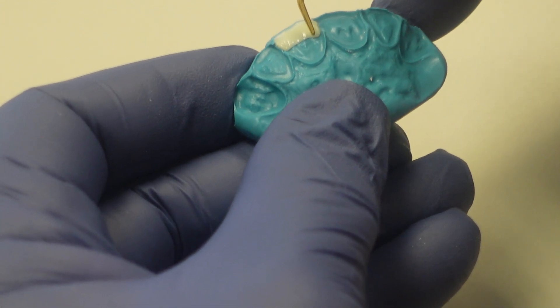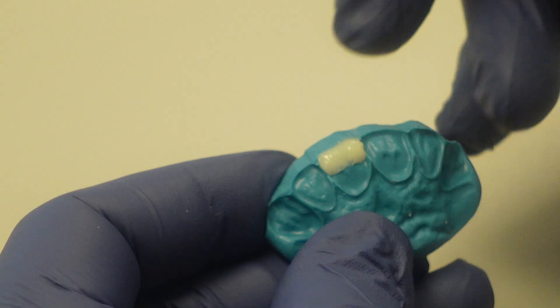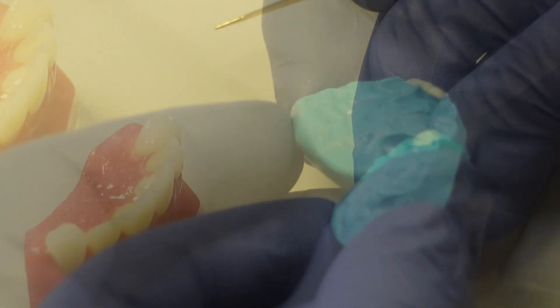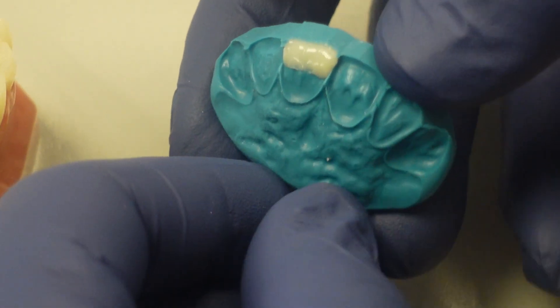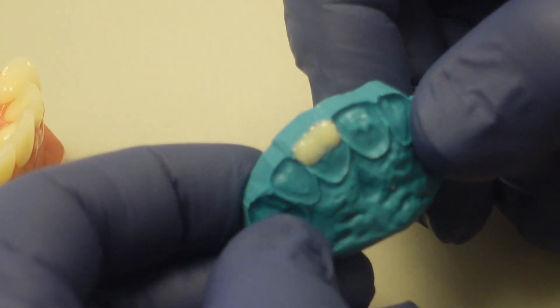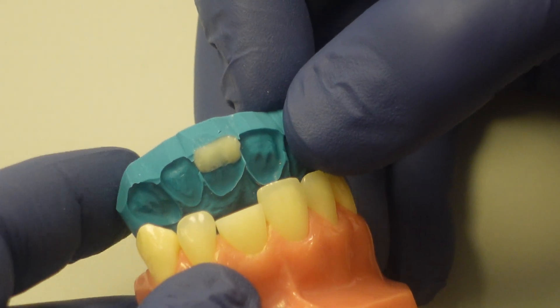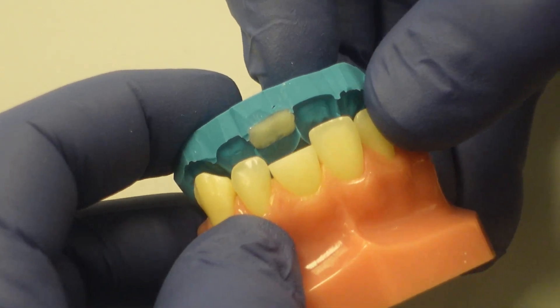Making sure that the base where it is going to adapt to the lingual of the tooth is pretty smooth — I don't want this to be a big ledge, and I don't want to be trapping air bubbles there either. From a profile view, you can tell it's not bulked out a tremendous amount. Another nice thing that really works well with this microhybrid is that it adapts so well. The lower viscosity compared to a lot of materials provides a really better option for getting it to adapt.